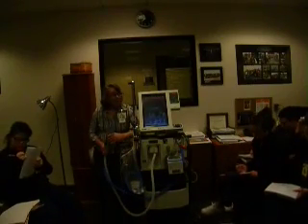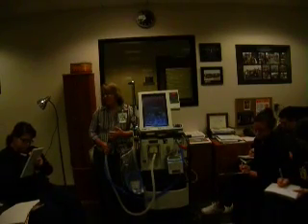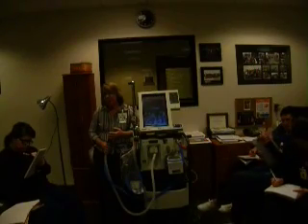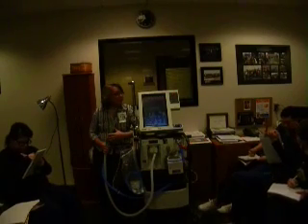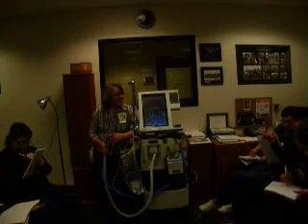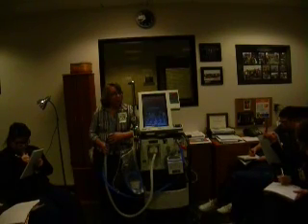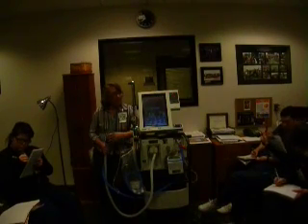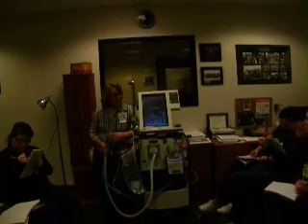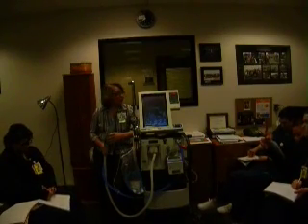The exception to that is when you have low tidal volumes. If your tidal volume is below 300, you can't use that same ratio because it'll put a low limit too close to 100. We want to know way before it gets to 100. So once you get below 300, we use 25%. You take 25% of the tidal volume and subtract it, and that's where you're low. So if your tidal volume is 300, 25% of that is 75, so you put your low tidal volume at 225. See how that works? Okay. So 300 and below, use a 25% rule for above and below. Above that, it's 200 above and 200 below.